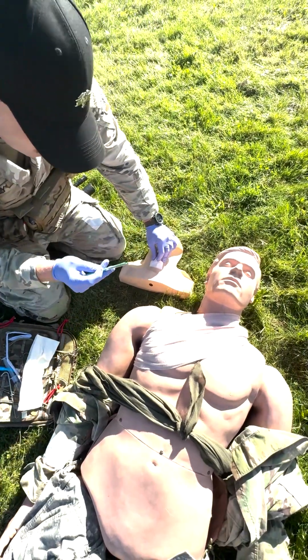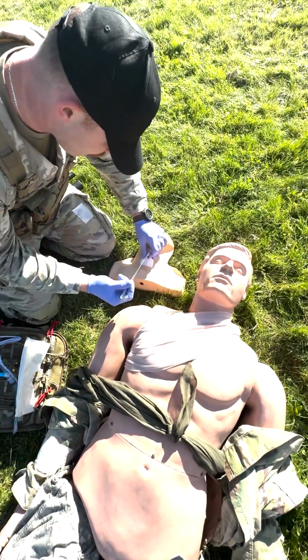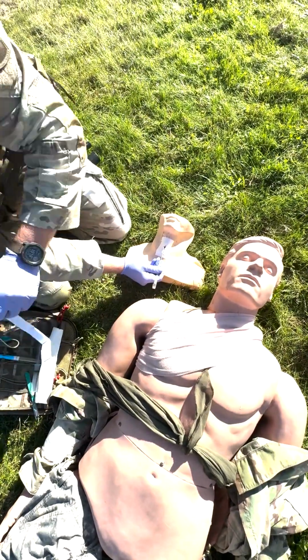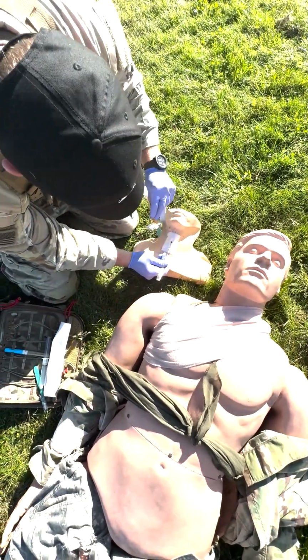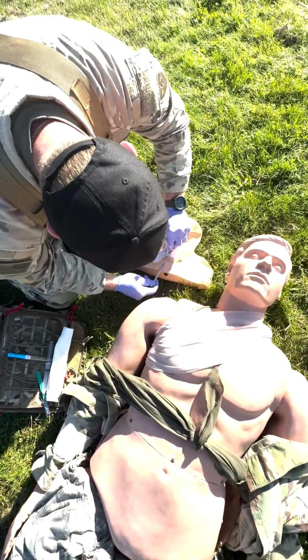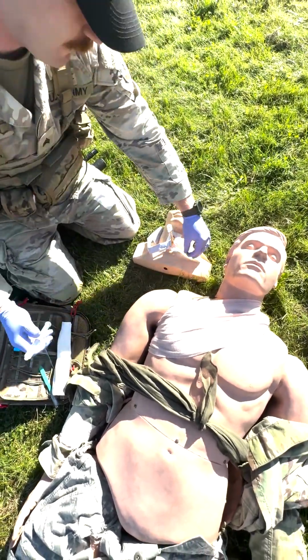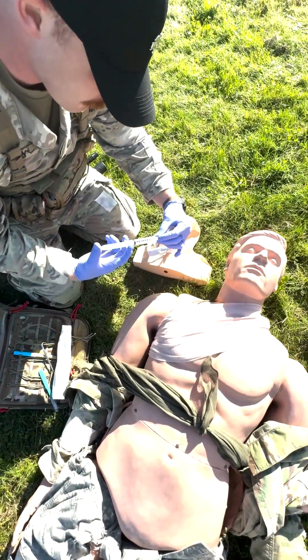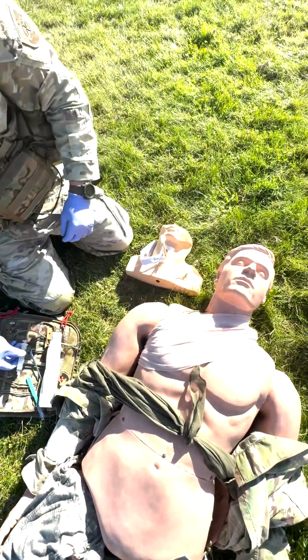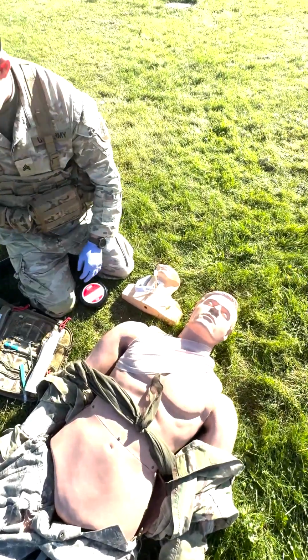Remove. Close my scalpel. Go take my trachea hook, insert, and elevate the cricoid cartilage. I'll then take my tube, insert it through the membrane down towards the lungs, while very carefully removing my trach hook. I'll then inflate my balloon with 10 mils of air, ensuring that my pilot bulb is inflated. Once that's done, I'm going to go ahead and confirm my placement using a BVM and stethoscope.